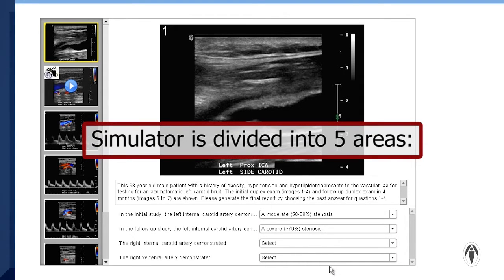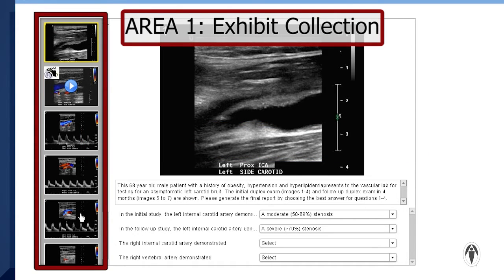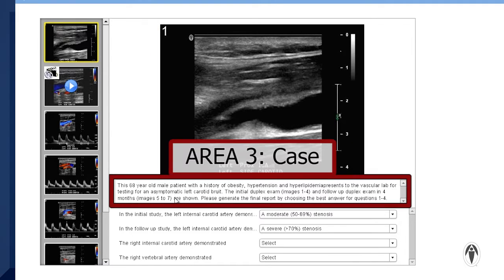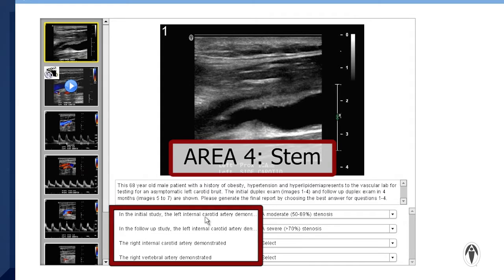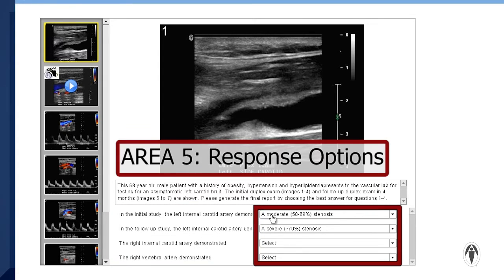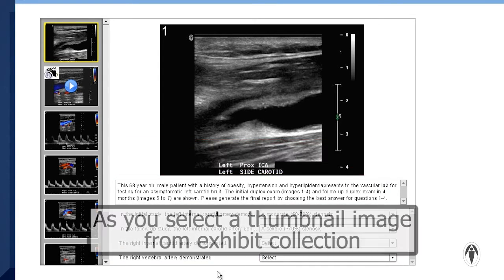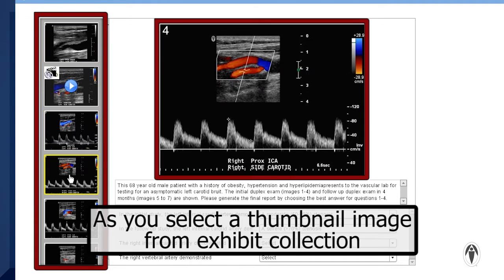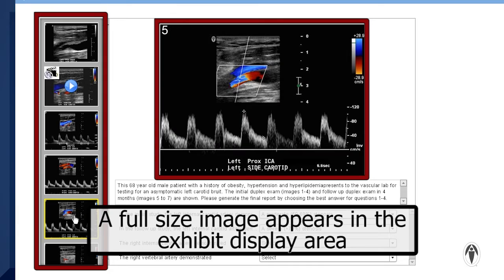The simulator is divided into five areas. Area 1 is the exhibit collection. Area 2 is the exhibit display. Area 3 is the case. Area 4 is the stem. And Area 5 is the response options. As you select a thumbnail image from the exhibit collection, a full-size image appears in the exhibit display area.